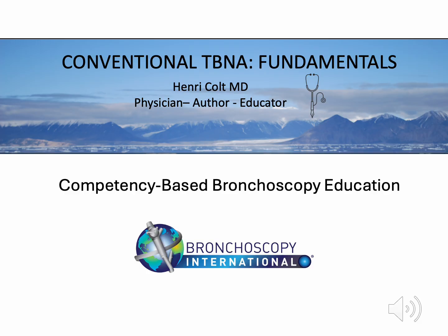In this lecture, we will review the fundamentals of conventional transbronchial needle aspiration, also called conventional TBNA. We will discuss its historical development, indications, equipment, expected diagnostic performance, procedural safety, and the principles that continue to make this technique an important part of modern bronchoscopy.